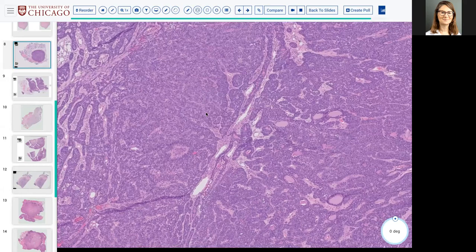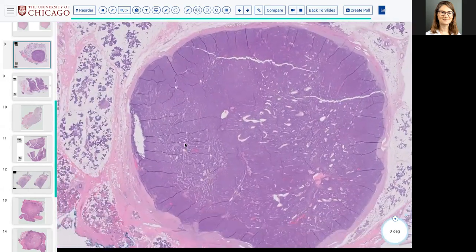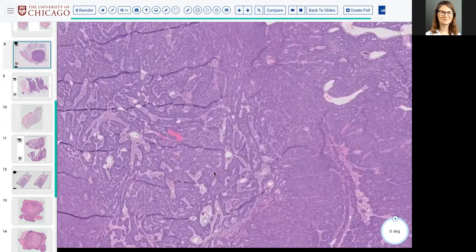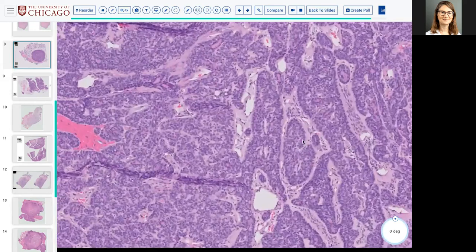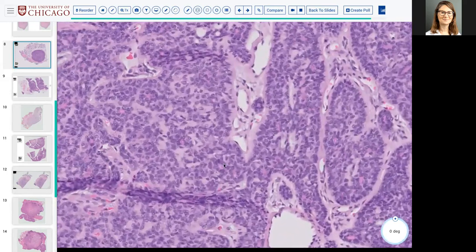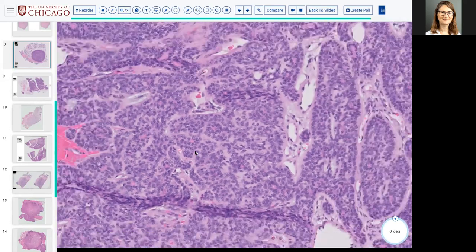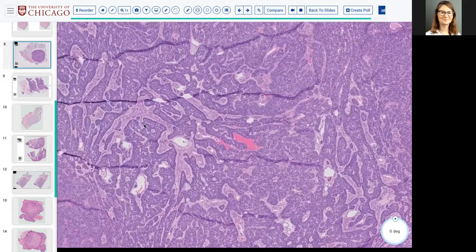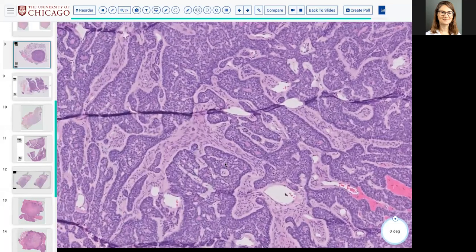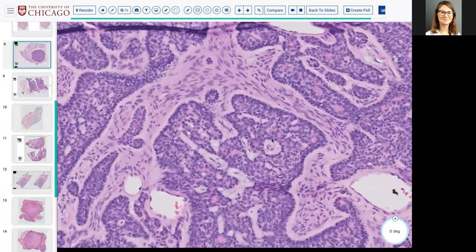It's a really characteristic case. On low power, you might think, could this be a cellular pleomorphic adenoma? And it may be, but there are a few subtle features, including this very tubulotrabecular architecture, this peripheral palisading, this hyalinized, globular, very eosinophilic basement membrane material. And lastly, what's sometimes discussed in basal cell adenomas, here it is: very streaming spindled stromal cells in the background between the tubulotrabecular nests.